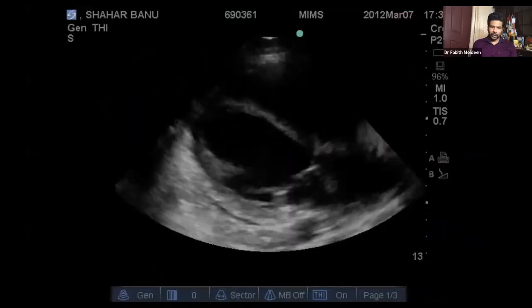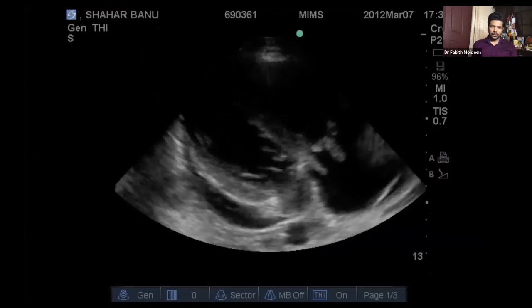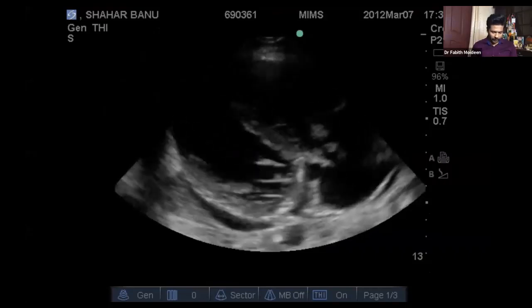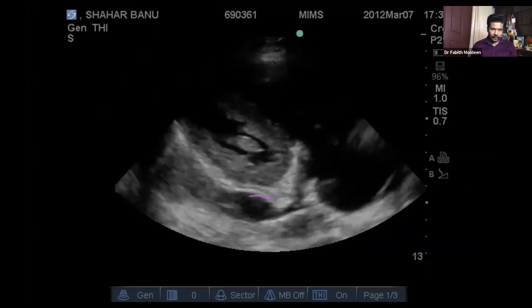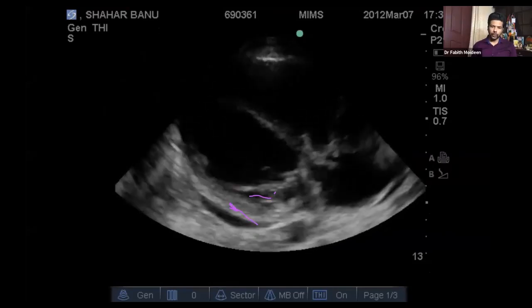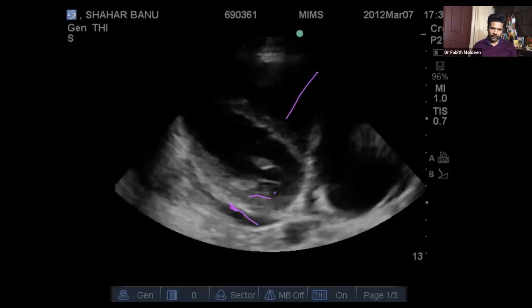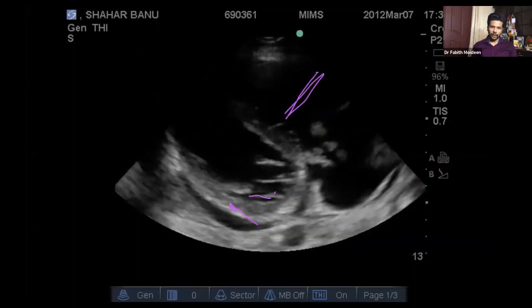Now, the next eyeballing, I already told you. Any suggestions? Anybody? Okay. Here also, you can see pericardial effusion here. You can see pericardial effusion, very good. The other thing you can see, probably people have noticed, is that the RV is dilated. Okay, the RV is dilated here.